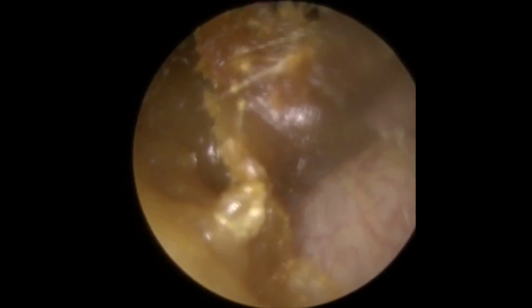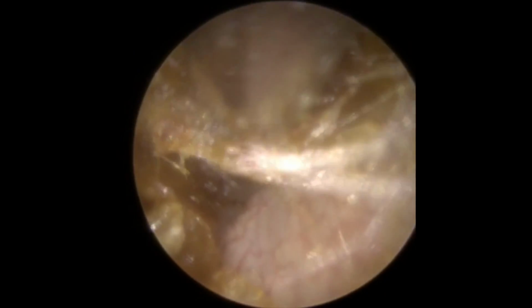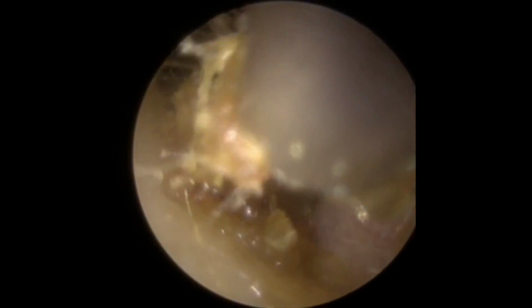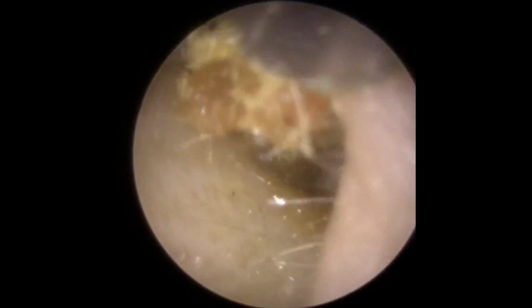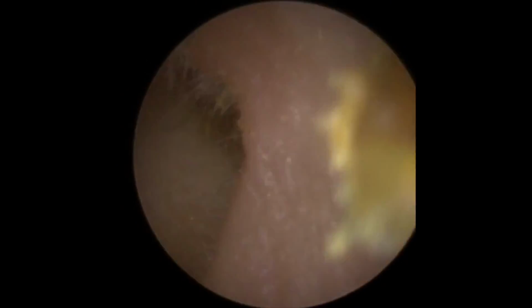There we are, just slowly working our way around, detaching the sticky, more solid pieces of wax around the outside edge first. There we are. You can see this dried up section here. There we go, it's starting to come away.